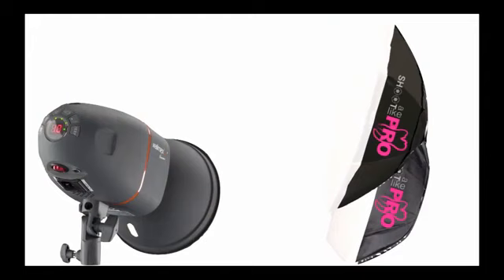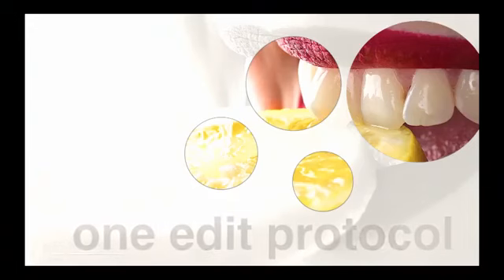Usually, the best possible result and the best daylight conditions you can reproduce with big studio lights. So that's why in my training center we have a special room designed only for photos and videos. Good. Edit protocol, it's almost nothing.